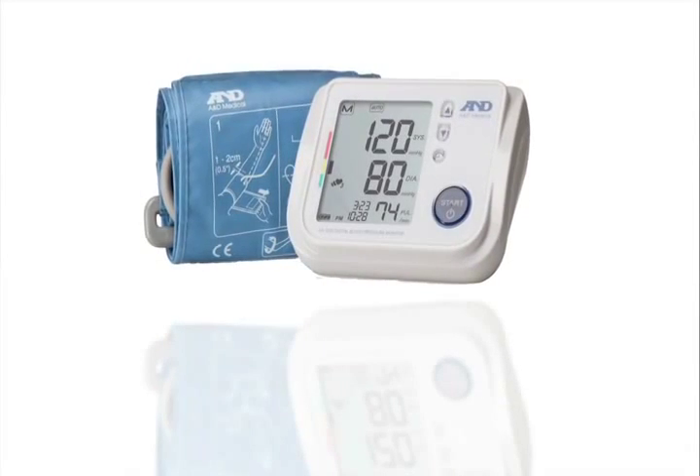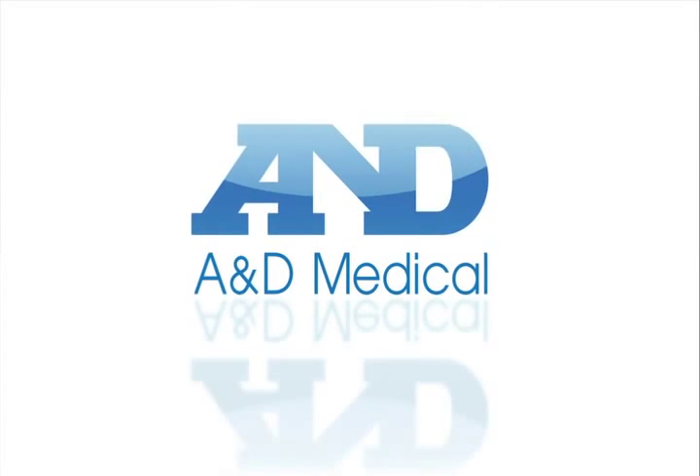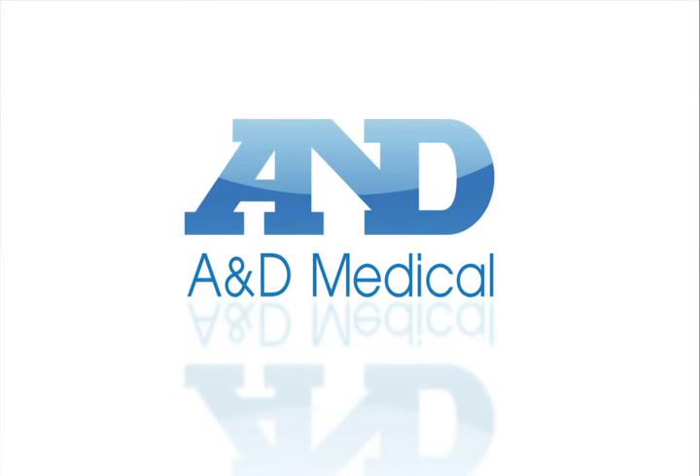Protect your good health with the Premier Blood Pressure Monitor. A&D Medical — at the center of your health.